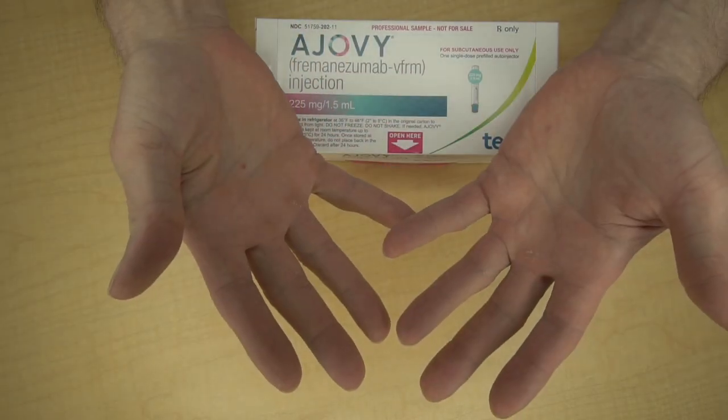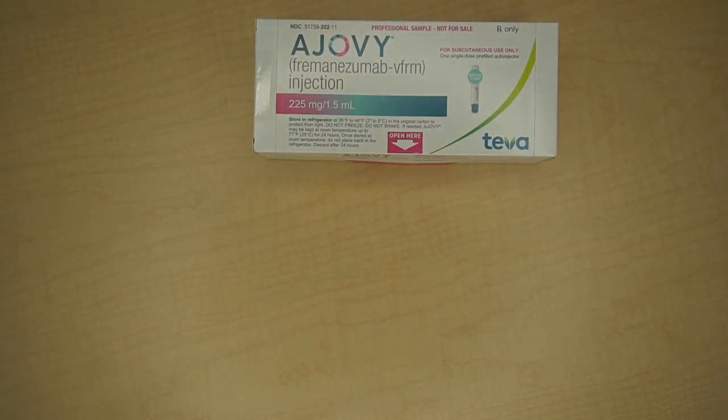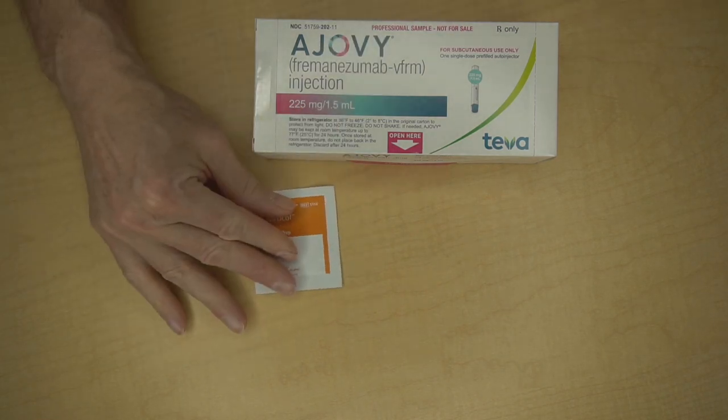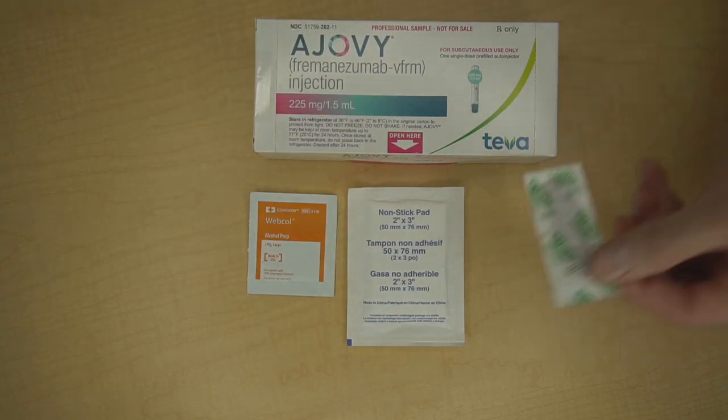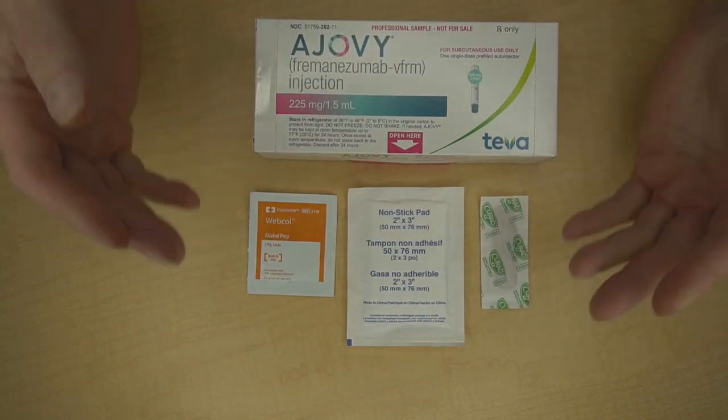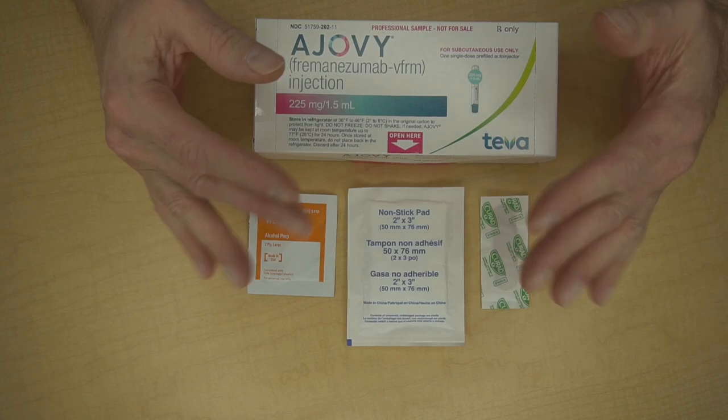To do the injection, you'll need clean hands, an alcohol swab, gauze or a cotton ball, a band-aid, and you'll also need a sharps container that's not shown here. You can pick one up from your pharmacy.